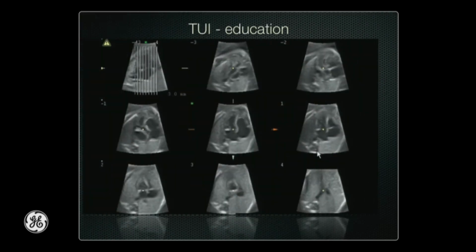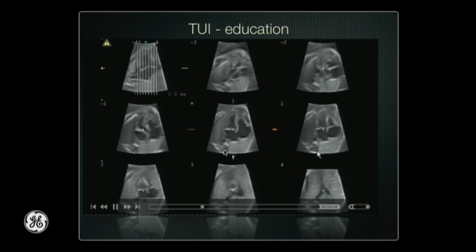And again, a very severe heart defect, it's an Ebstein's anomaly. And this is the original image, the start image where I acquired the volume, and clearly you see all the typical features of this Ebstein's anomaly: the low insertion of the septal valve of the tricuspid valve, the paradoxical movement of the ventricular septum, and this is only the right ventricle, this is the left ventricle. And again we also see pulmonary stenosis, because the pulmonary trunk has a thinner diameter than the aorta.